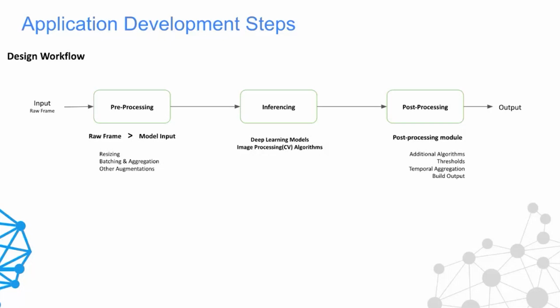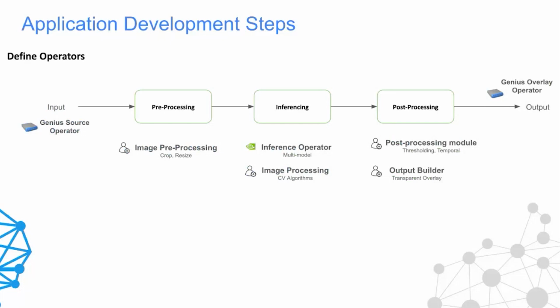Once you have designed your workflow, the next step is to convert them to operators. Over here, I'm using the GI Genius Edge Device Source Operator, which connects to the capture source and gets the live image from the endoscope to the Holoscan pipeline. All the other operators are defined by EndoVision, except for the inference operator. This is a multi-model AI inference operator, which is an inbuilt operator provided by Holoscan. And finally, the output operator is again provided by GI Genius, that directly overlays the image on the output screen.